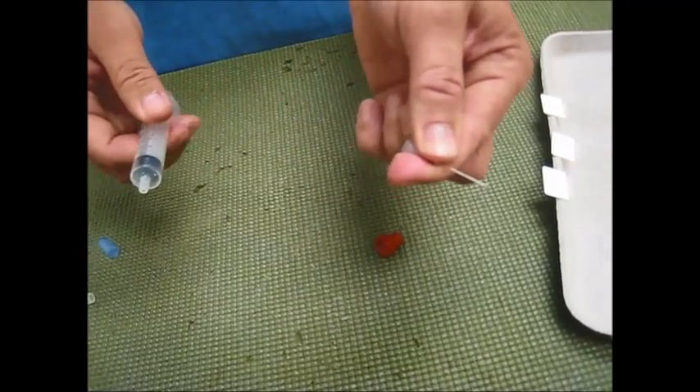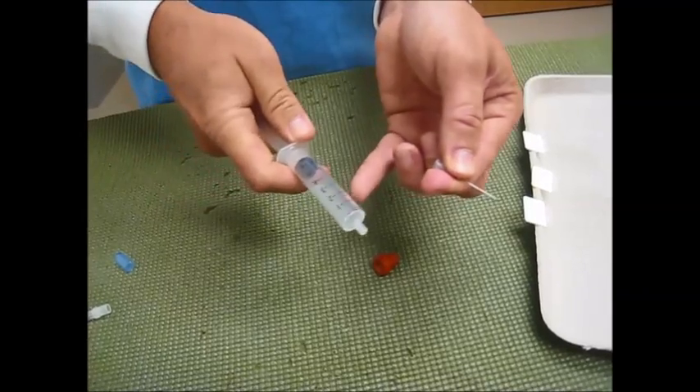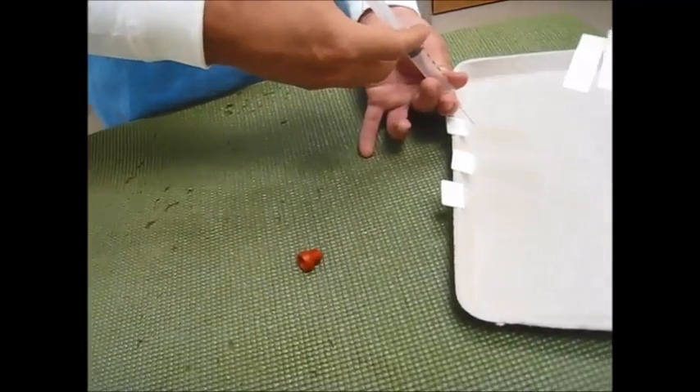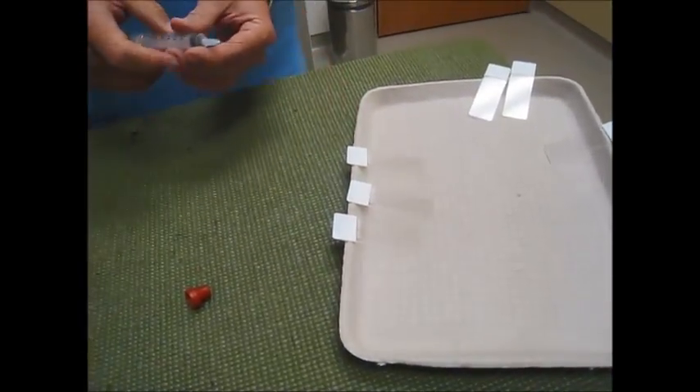Then without any pressure on the plunger you're going to remove the needle and syringe. Take the needle off of the syringe, pull the plunger back to 6 cc's, reattach the needle and eject the aspirated material onto the slide.